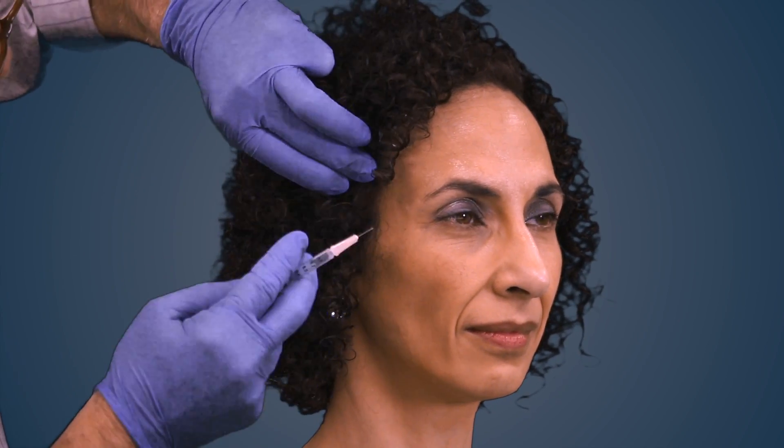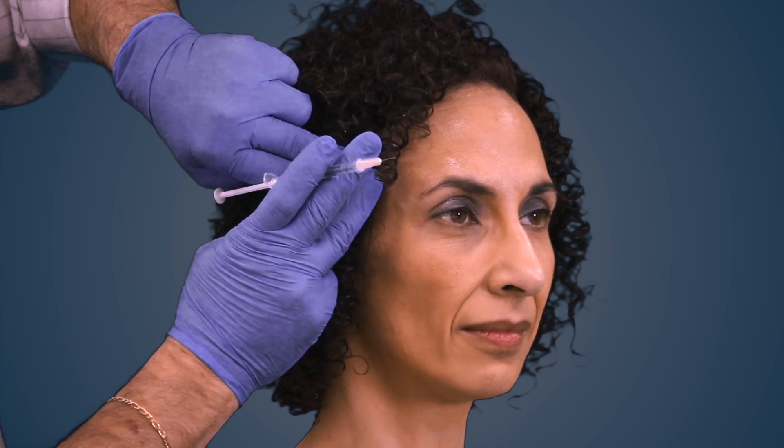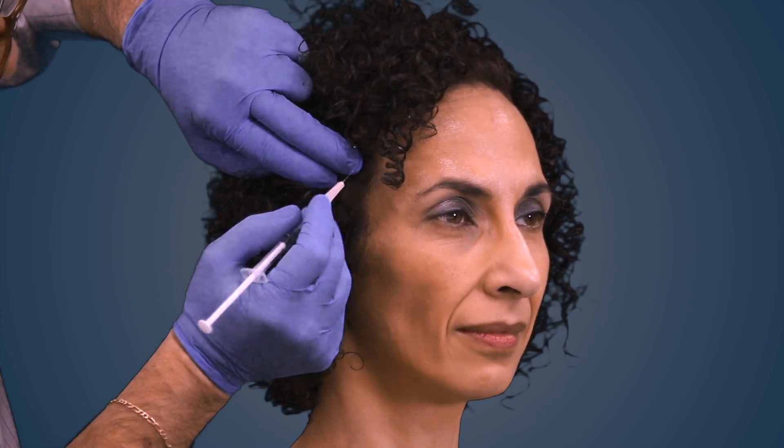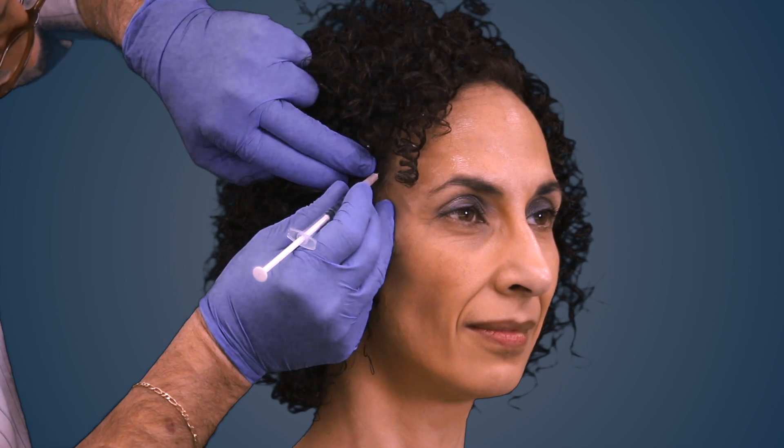We then palpate the temporalis. Clench for me. We feel the muscle and inject 5 units in the anterior belly and then another 5 units in the mid-belly. Clench. Relax.